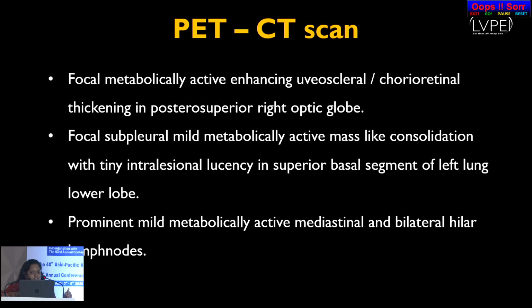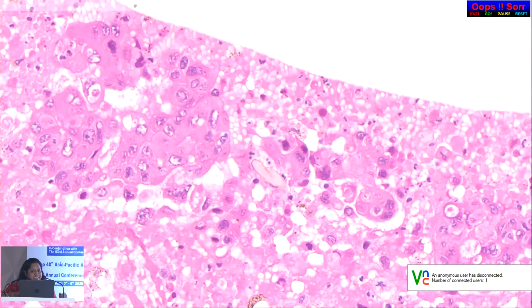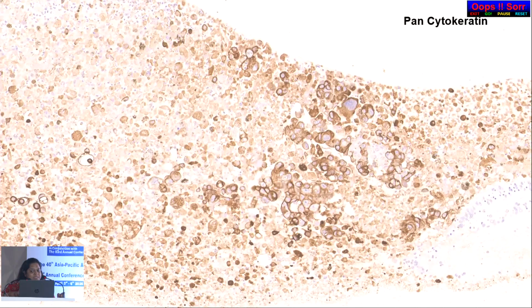The PET-CT also showed a focal subpleural metabolically active mass which appeared like consolidation, and other than that there were mediastinal and hilar lymph nodes. Now this was the choroidal biopsy taken, which showed a faint acinar type of cells along with the retinal cells, and this was the morphology of the case, which also showed an acinar pattern. Alcian blue was done, which showed intracytoplasmic mucin, and pancytokeratin was positive in this, and Melan A was negative.